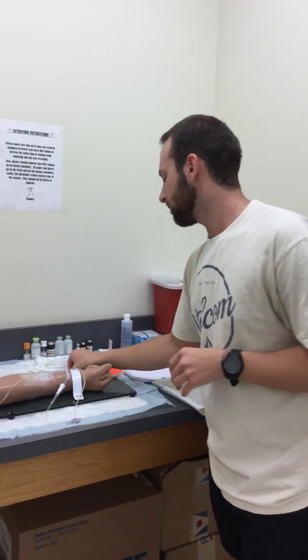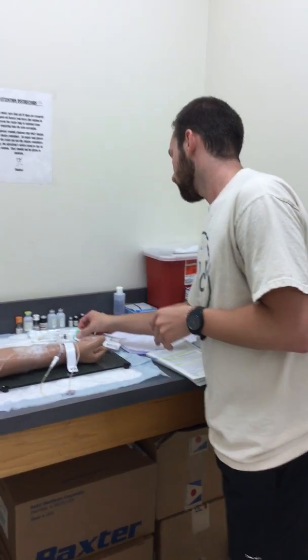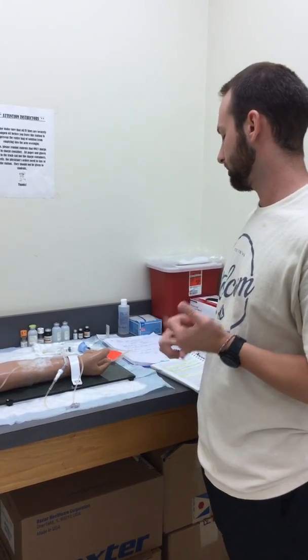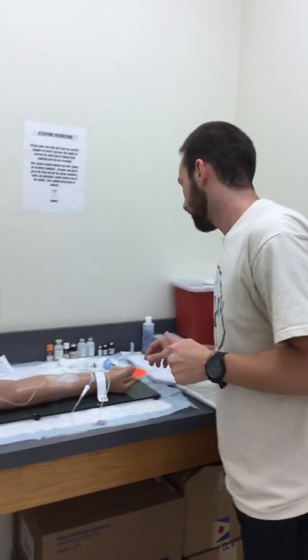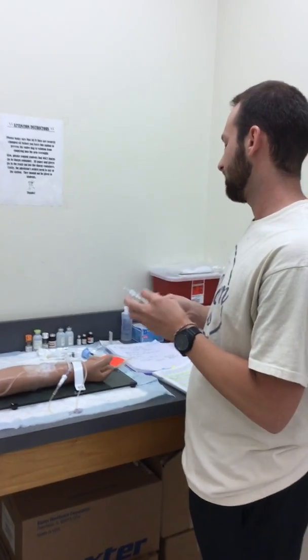And for digoxin, we're going to want to make sure that we do the apical pulse rate for 1 minute and make sure it's above 60, and we're going to want to watch and make sure that it's in good therapeutic level. Okay, we're going to want to make sure we have the correct solution. We're going to want to make sure that we have the correct medication and dosage. We're going to clean our hands before we get all of our stuff together.